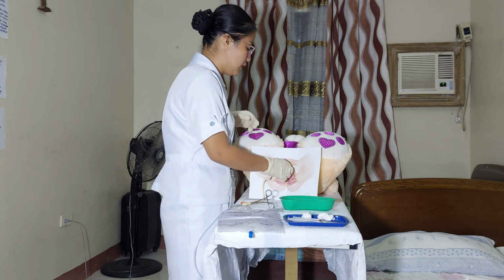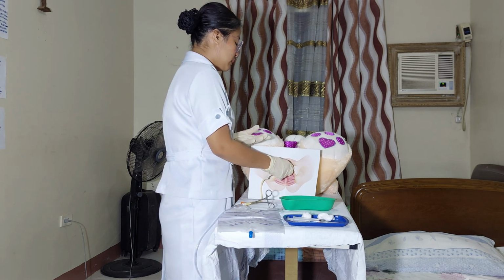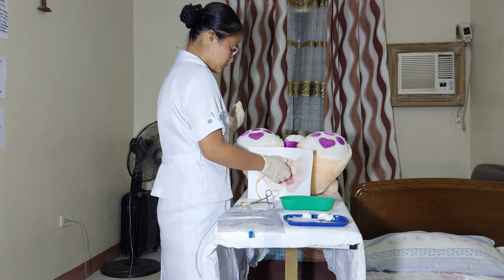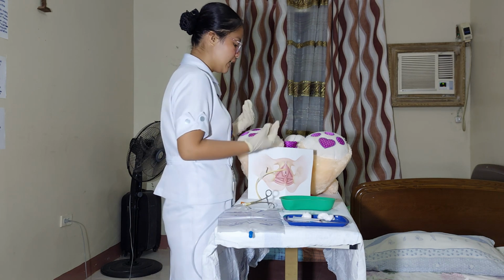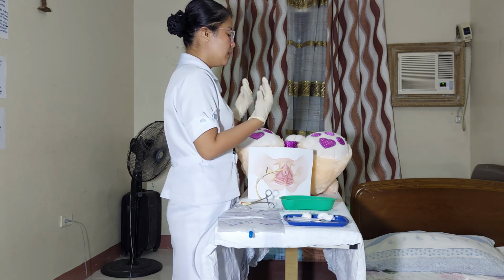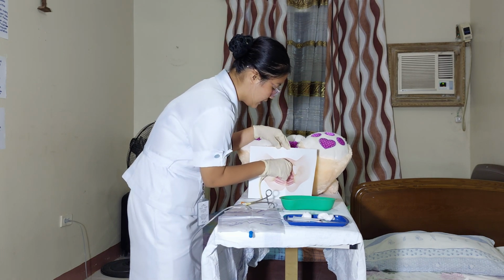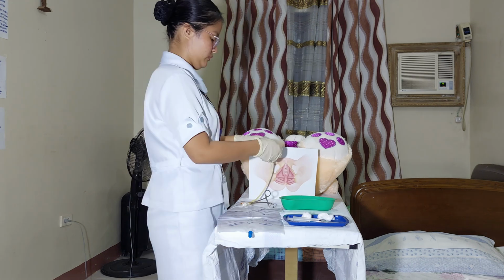Ma'am, can you inhale po? I'm going to remove your catheter now. Can you inhale and exhale po? When I say inhale, you inhale, and when I say exhale, you exhale. Okay po? So, inhale po ma'am. Inhale po ma'am. Exhale po ma'am.